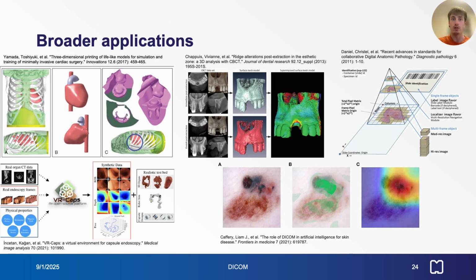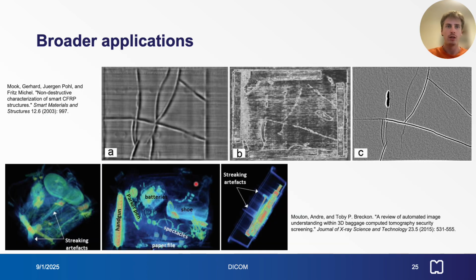Although initially targeted towards radiology-specific applications, the DICOM standard is not restricted in scope and includes support for other medical specialties such as cardiology, dentistry, endoscopy, dermatology, and pathology. DICOM has also been extended beyond the scope of medicine to include non-destructive testing of aircraft parts, as well as baggage screening and other security applications.